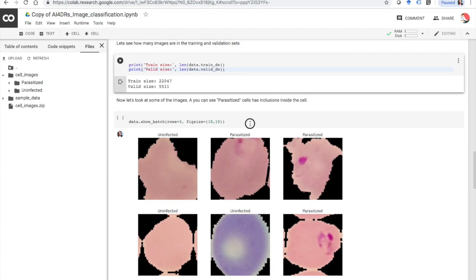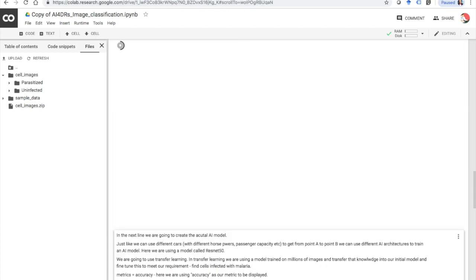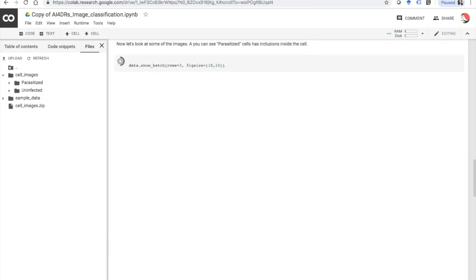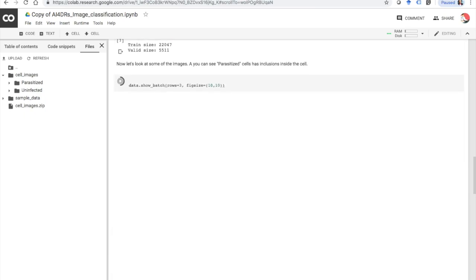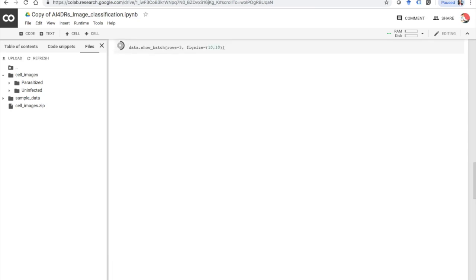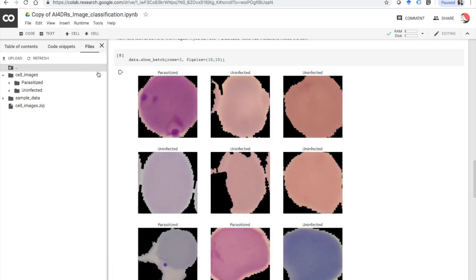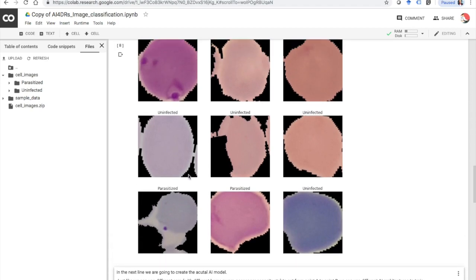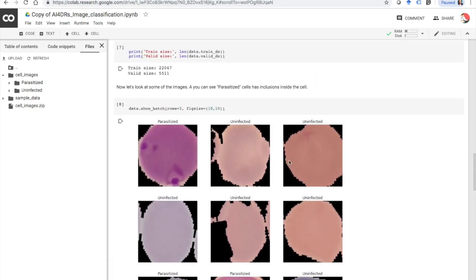Now let's take a look at all these images — it's going to take a few seconds to load up. As you can see there is the label of the image: parasitized or uninfected. The parasitized cells have malaria inclusions here, but the uninfected cells do not have any inclusions.